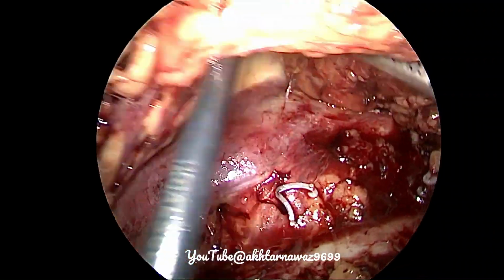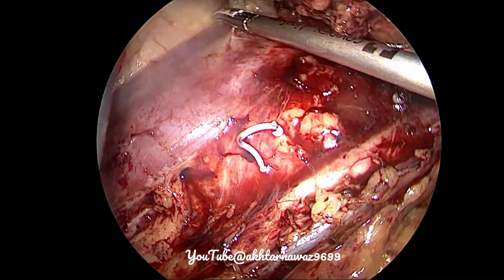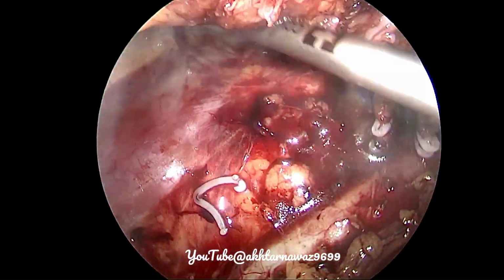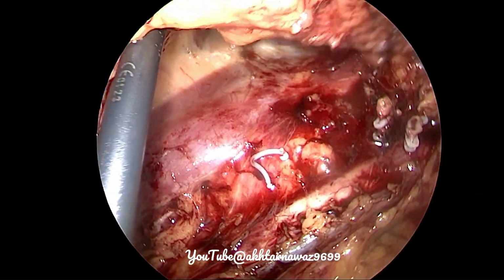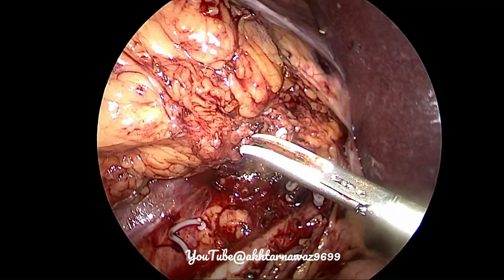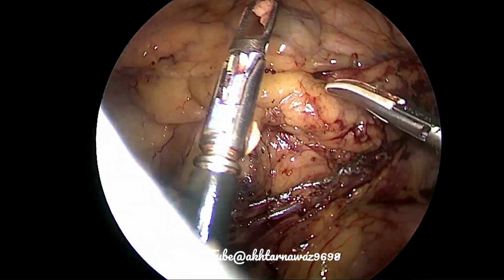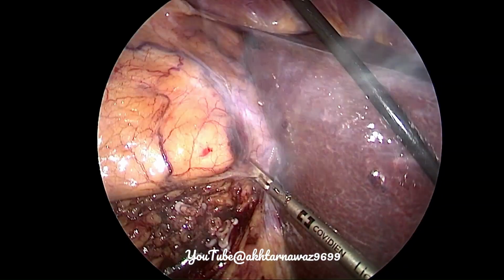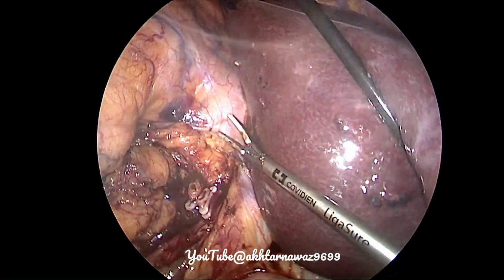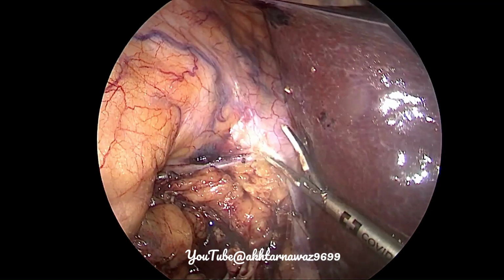Now we dissect the posterior aspect of the kidney as much as possible, so that only the peritoneal layer remains, and that can then be easily removed or dissected or cut later on. So we start with the peritoneum along the superior border of the artery.